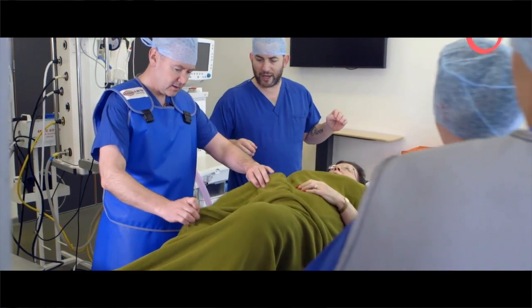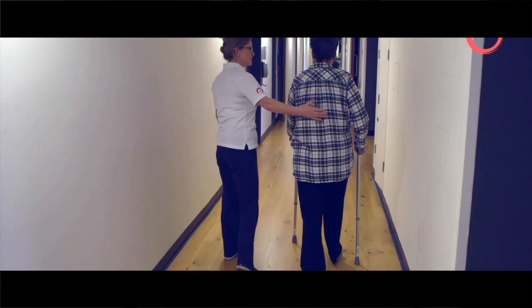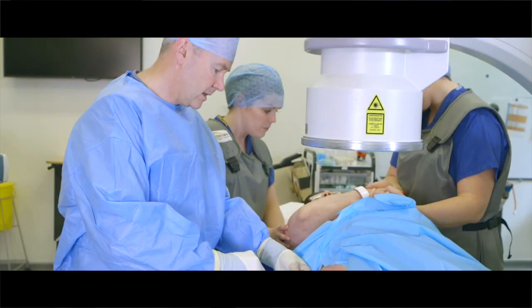Wonderful. I feel a hip joint injection is a really beneficial thing for patients. Not only do you have the diagnostic benefit, you also have the therapeutic benefit, and it offers a low risk strategy for managing some long-term conditions.